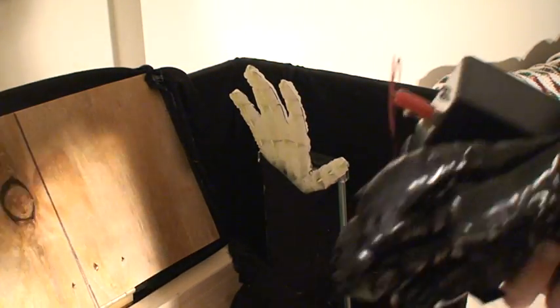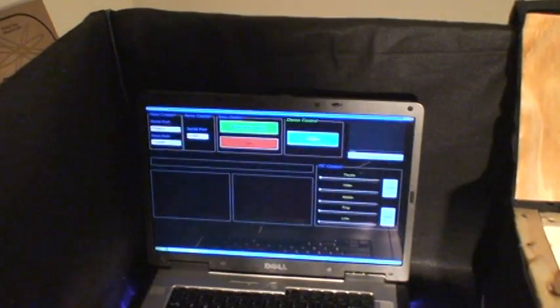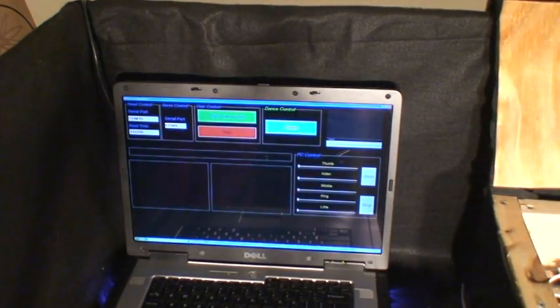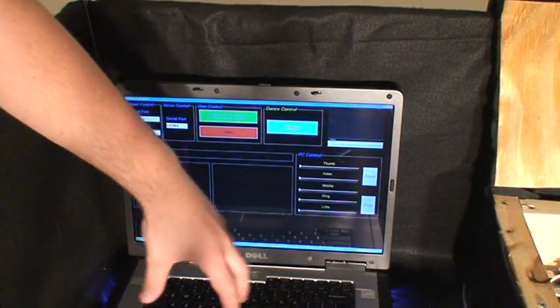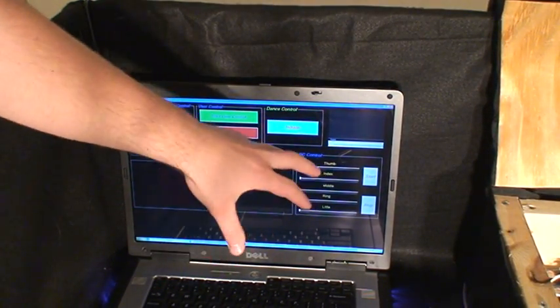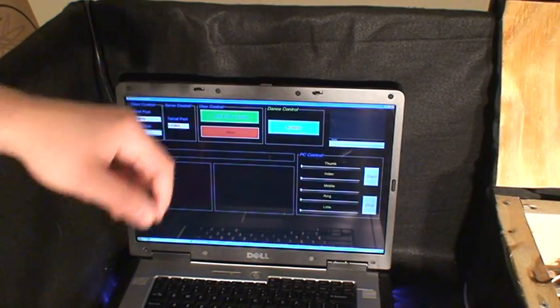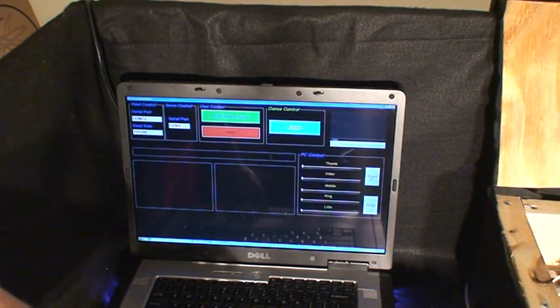So it has three methods of control. The first method is slider bars. You can move each finger very precisely from the computer. If I just hit start, it unlocks the slider bars.